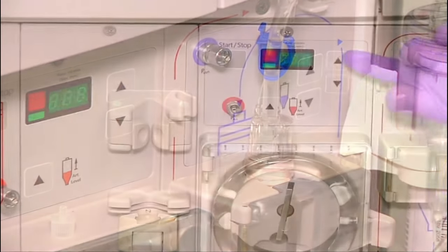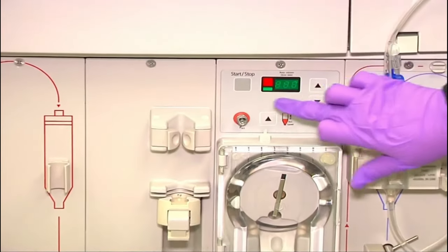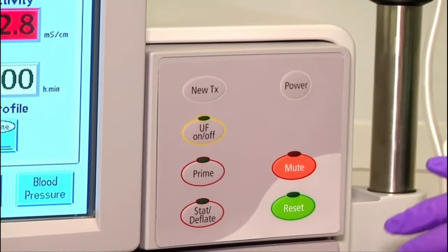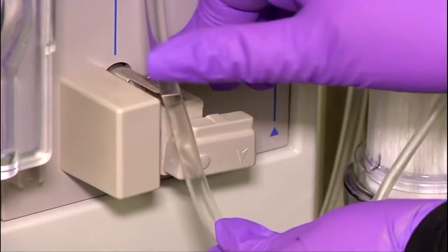The dialysate delivery system also monitors the filtration rate, either indirectly by controlling the TMP, pressure-controlled ultrafiltration, or directly by controlling the actual filtration, volume-controlled ultrafiltration.